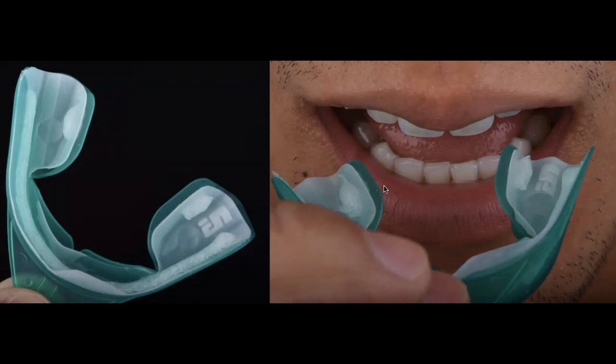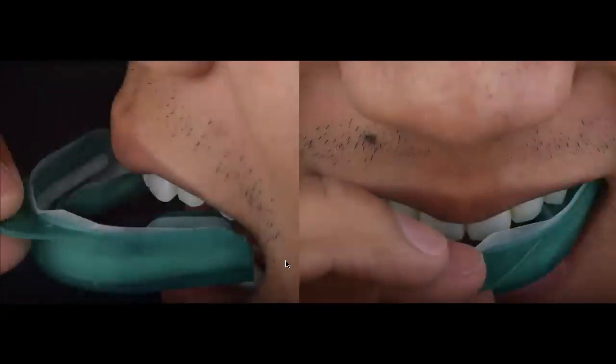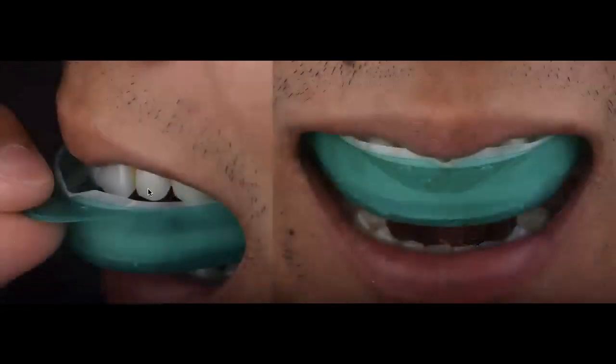And on the lingual side, on the molars, just to keep the tray, you have another gel that is just to make this stick to that area so that the tray doesn't fall down on the back. So it's a very nice design prefabricated tray. But again, you have to train your patient how to use it. So the first thing that I tell them is just to grab the tray from the handle and go ahead and fit it in their mouth. You can see that he's going in with the tray. He's now in his mouth. He now knows that the tray fits well. Once that tray is there, and you will see a side photo, you see he's ready to deliver the tray. He now sits the tray on the teeth.